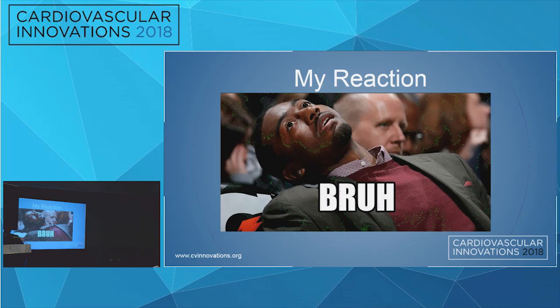So I'm looking at this, and my initial reaction is this. I'm thinking to myself, I've got 4 outpatients today, I've got 2 TEEs, I've got to give a fellows talk, and this is my first case, and I'm going to be tied up in this, and I don't even know what is going on here. I've never seen anything like that in the proximal right coronary of any patient that I did in fellowship.